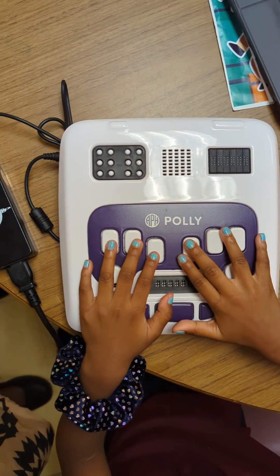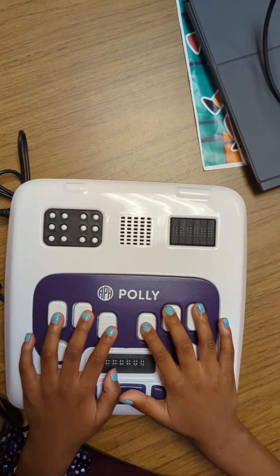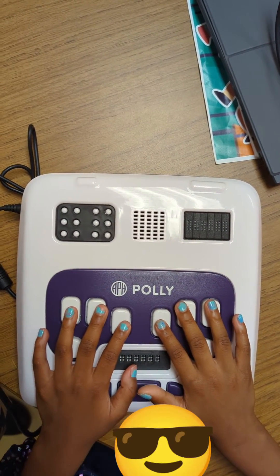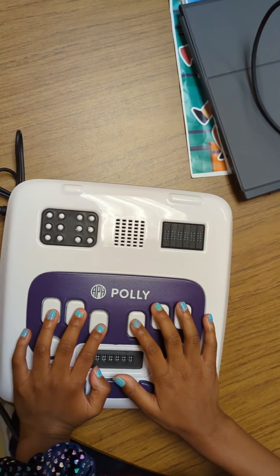I will ask you to type the keys and you type them for me. Remember, if I ask you to type more than one key, press them all together. Now press key one.